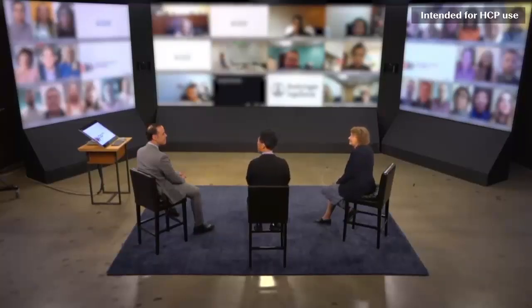I have one question for Juan. I know you spoke on fibrosing and non-fibrosing hypersensitivity pneumonitis, and certainly that can be on people's differential diagnoses, not only as a radiologist, but as the clinician. So how often should you be getting expiratory imaging in your HRCT protocol?